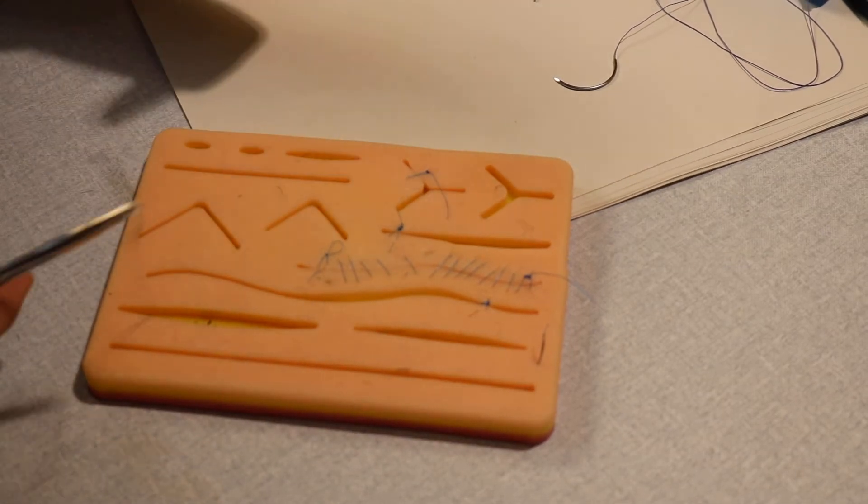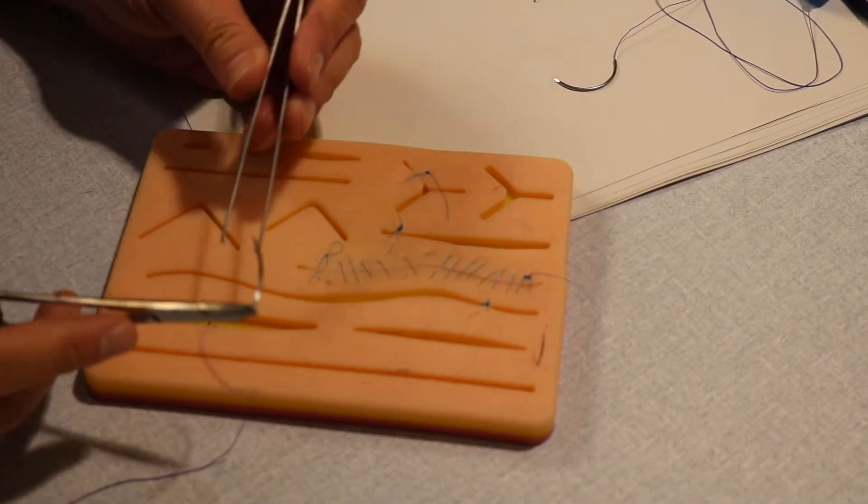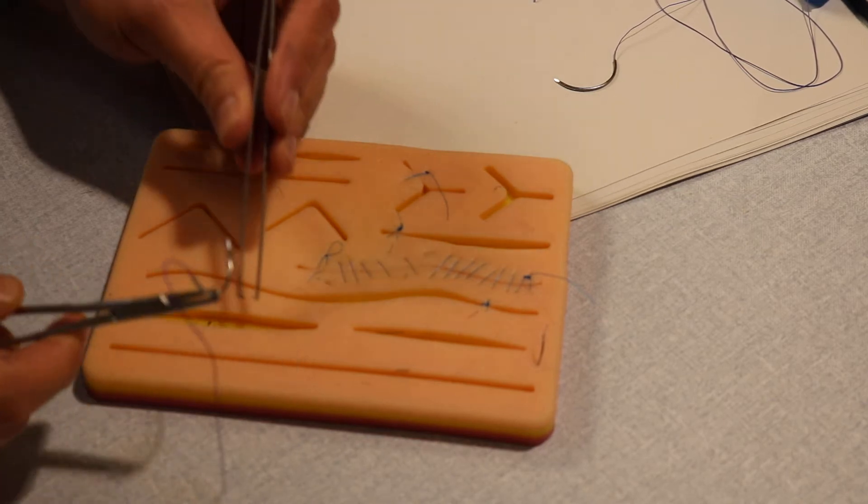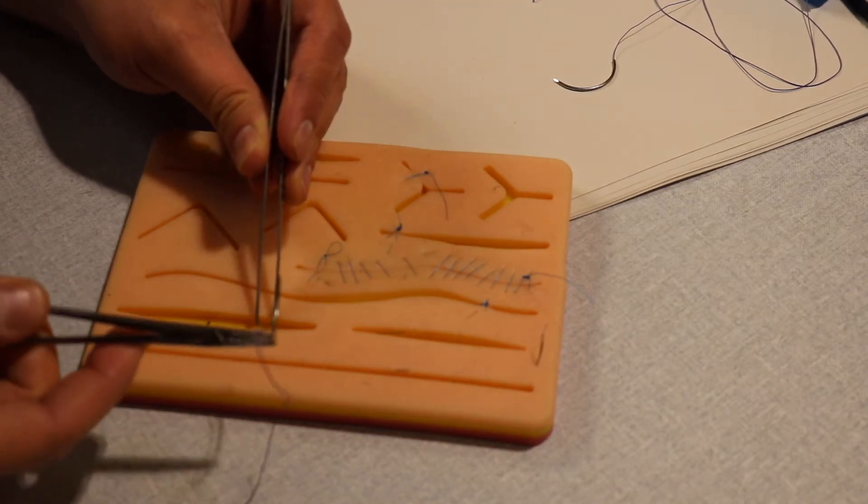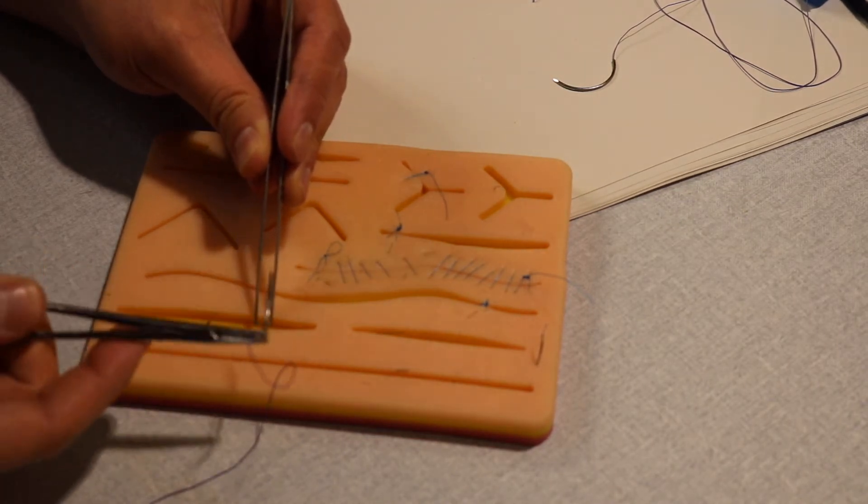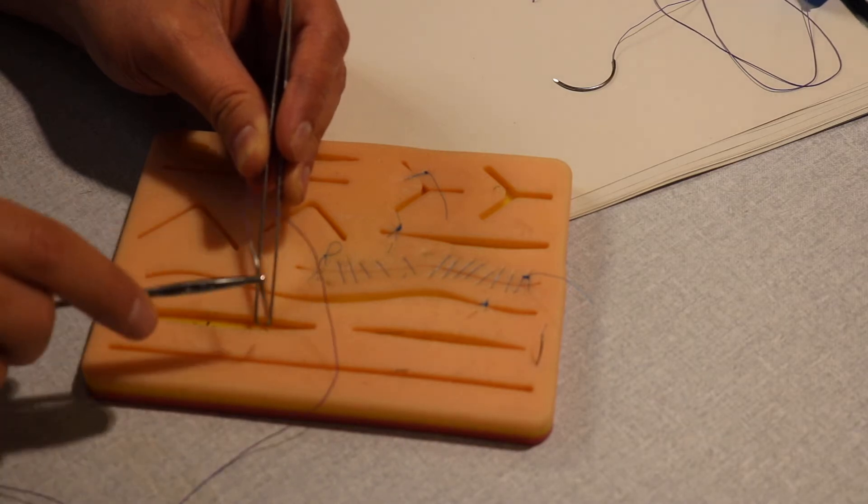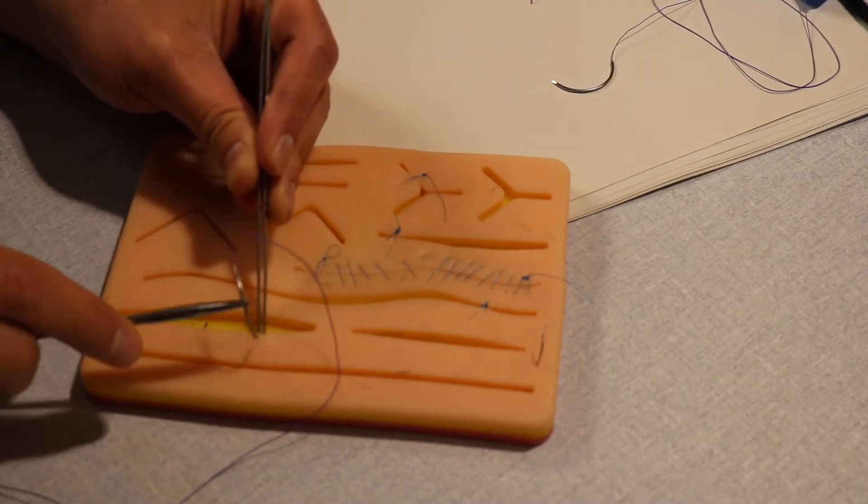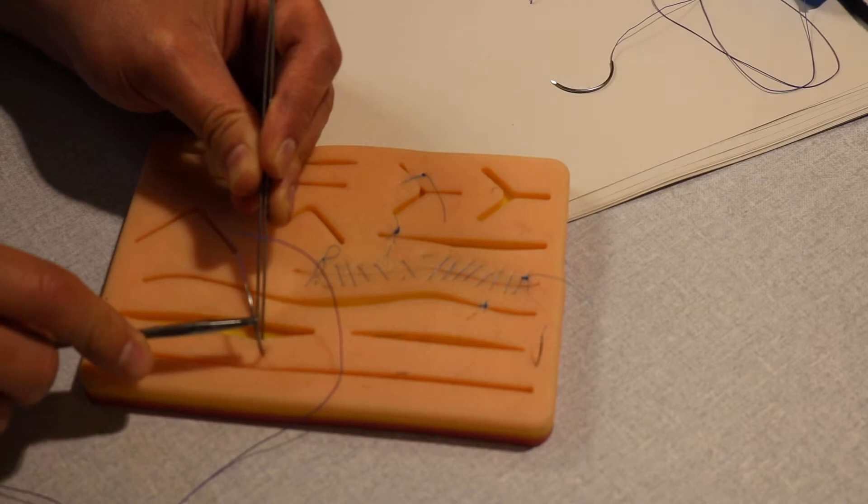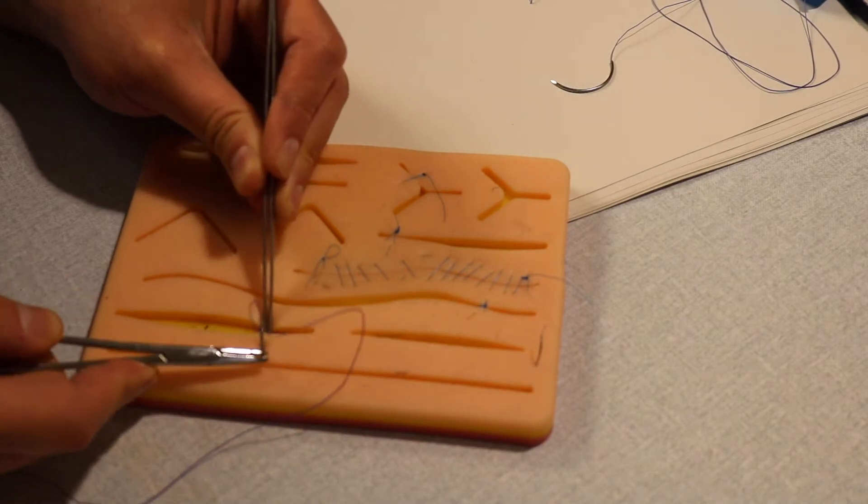Okay, pitfalls that I've seen people doing. I'll do the stitch. I need to go perpendicular, so I need to rotate my hand and the edge both at the same time and go rotational.